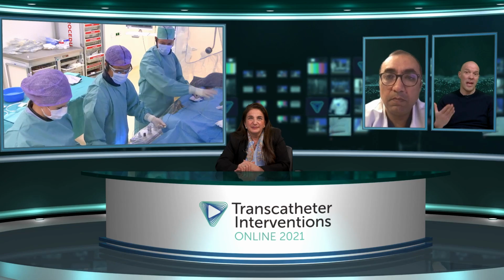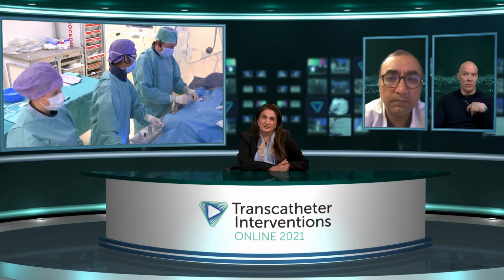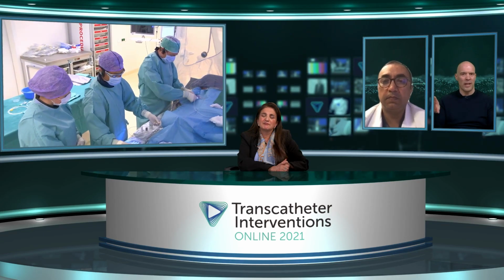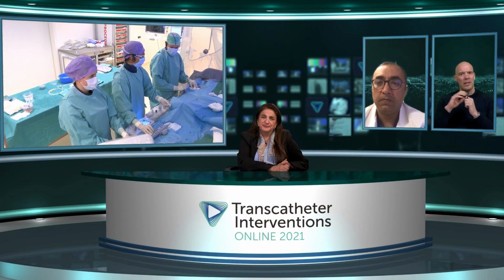So this is a patient that was referred to us from another hospital, and we have the luxury to prepare the case, and then often we decide based on the angio which kind of technology we would want to use up front. But of course, sometimes during the procedure, as you are interrogating the lesion with invasive imaging, you get advanced insights. I think you could definitely also consider using a shockwave balloon, but you have now a very long segment that you want to tackle. You have a focal circular lesion, and then you have a more eccentric lesion distally.